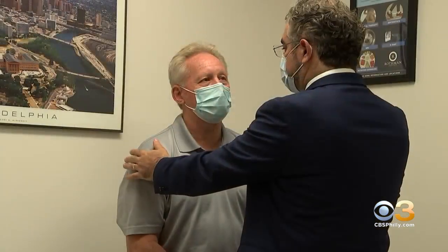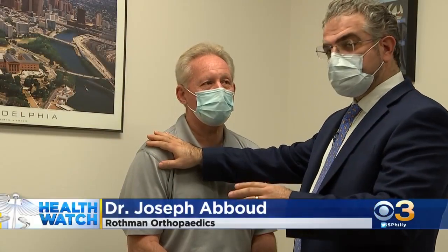Paul has had a series of shoulder operations. This time, instead of the standard repair surgery, he was eager to try something new. Paul was the first patient in the United States implanted with the InSpace device.